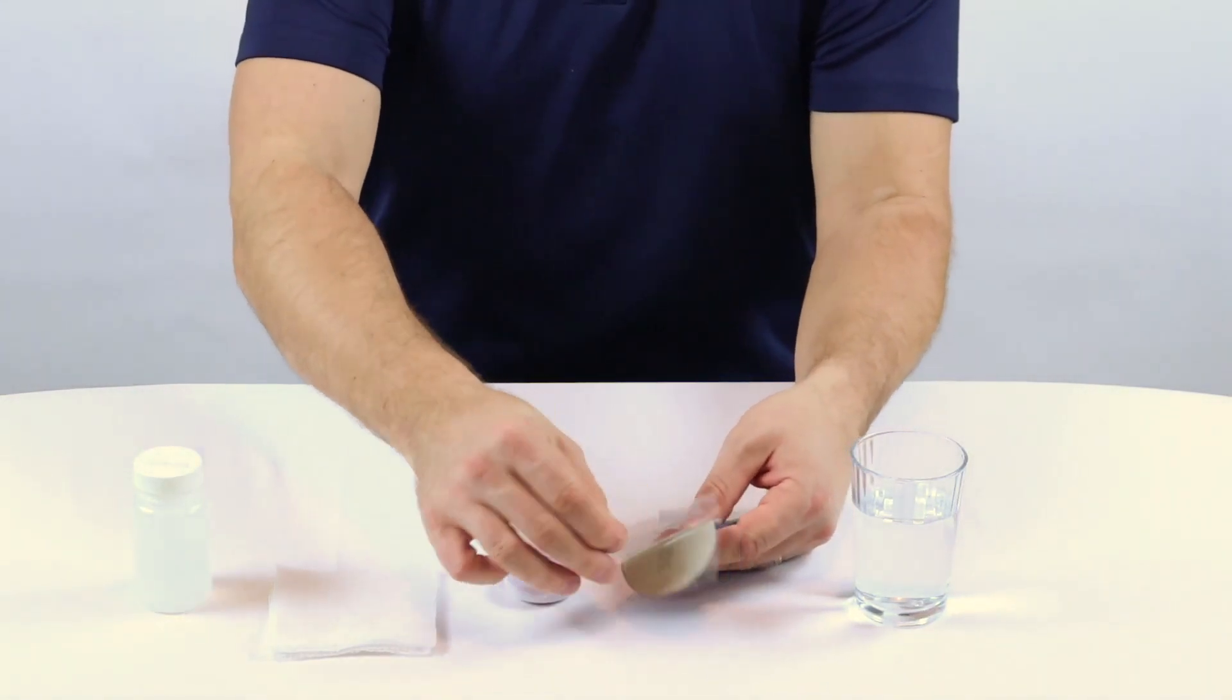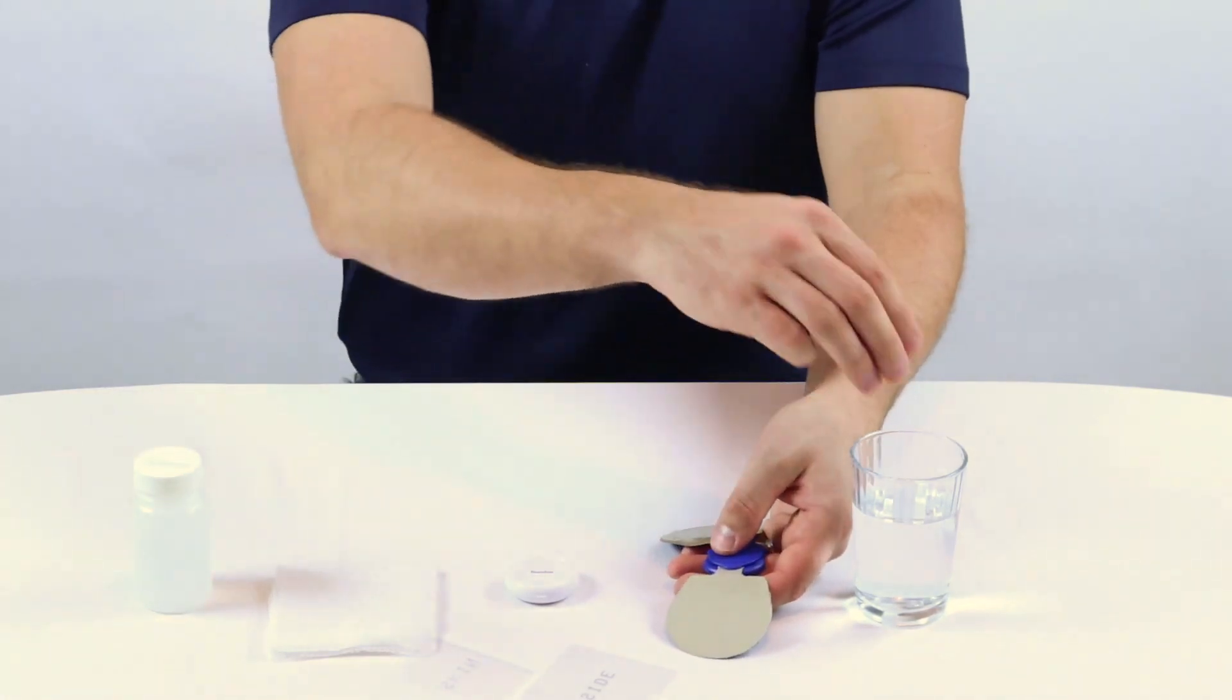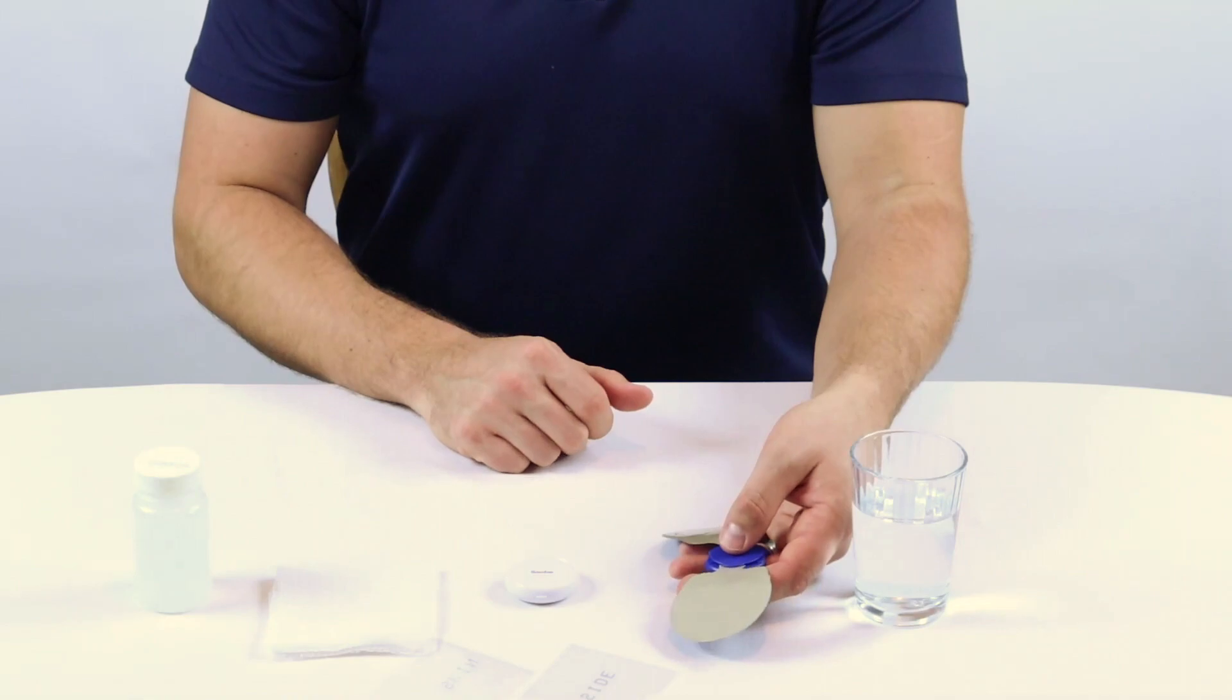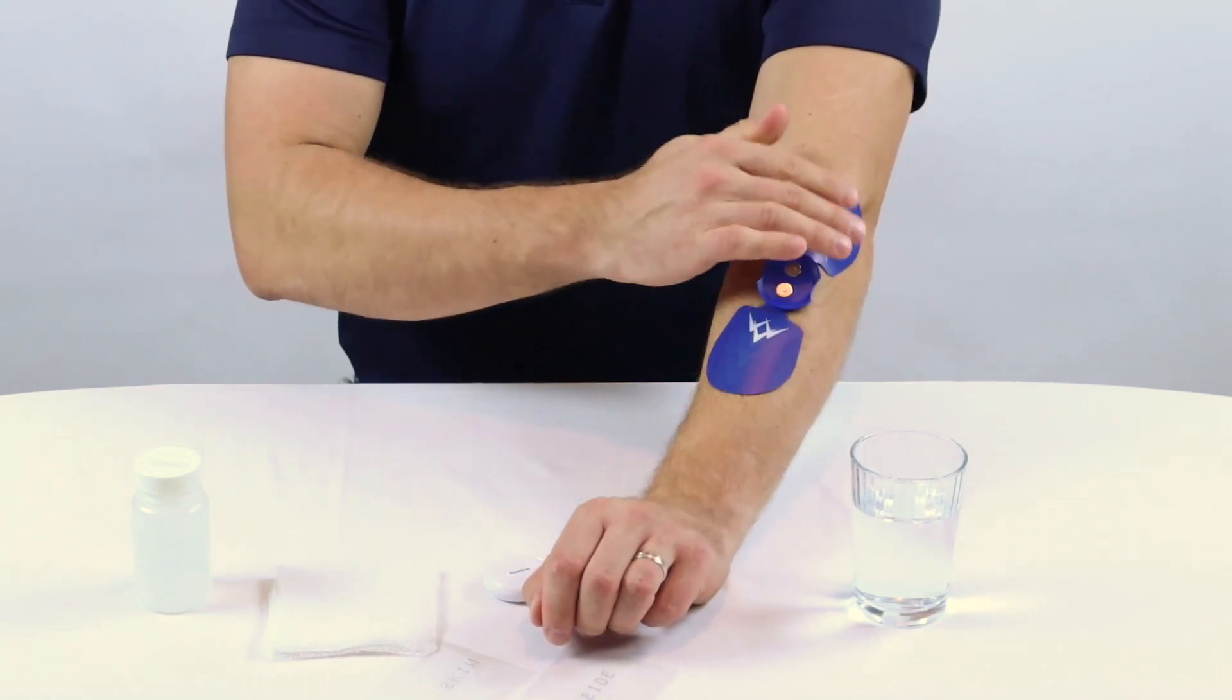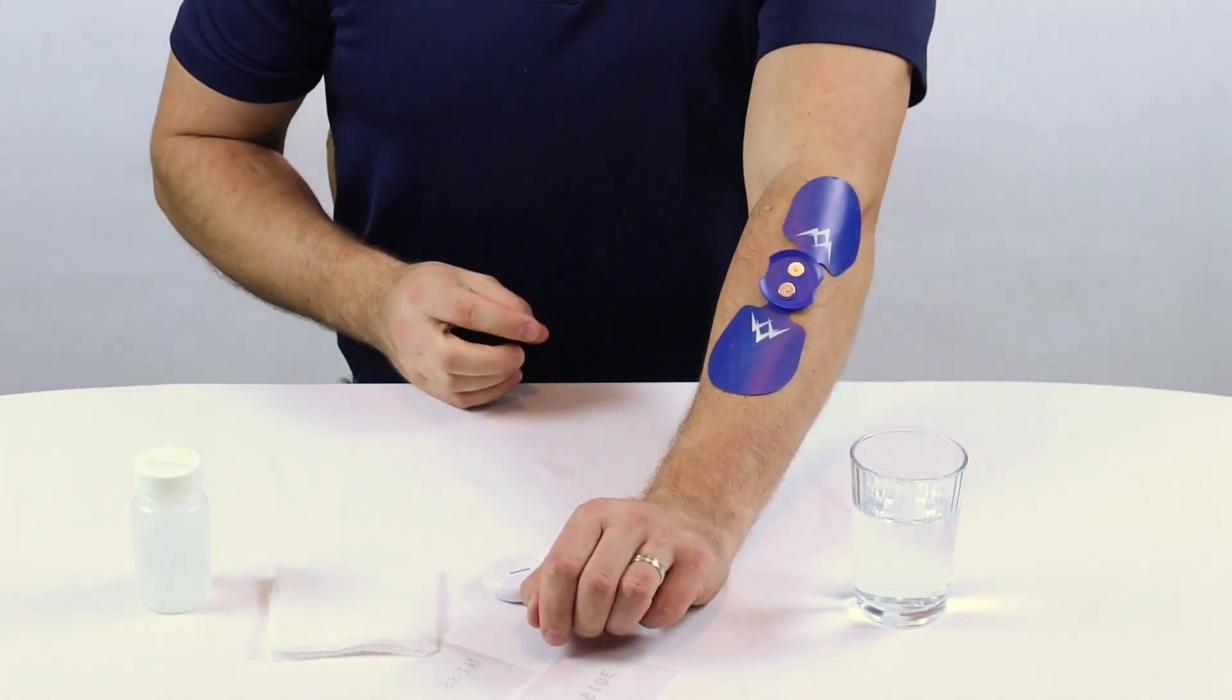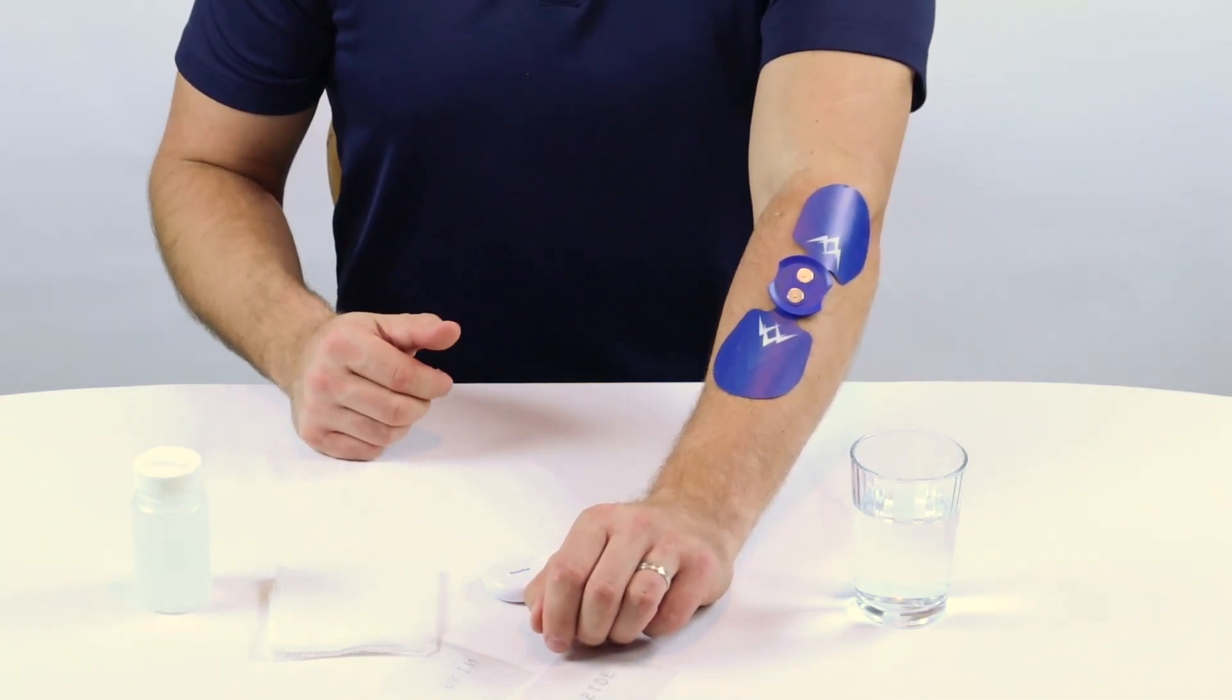Also, when applying your gel pads, if you find that they are not sticky, you can apply a little bit of water before you apply them. Then finally, apply them to your skin for the exercise, but make sure that you press firmly to adhere to the skin. If you find that they aren't sticking in certain areas, you may want to replace your gel pads.